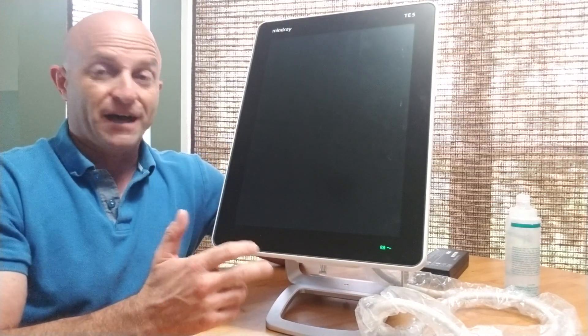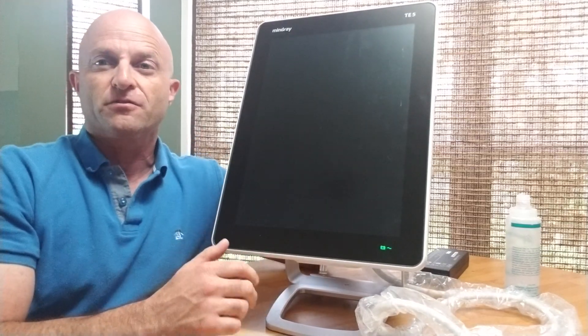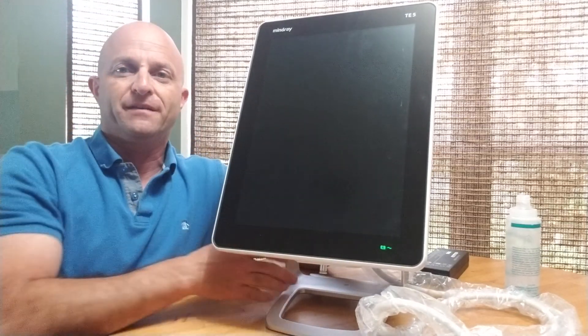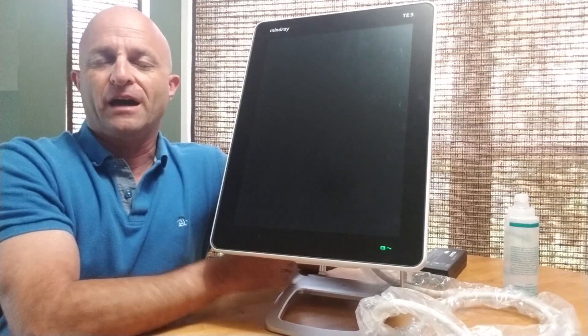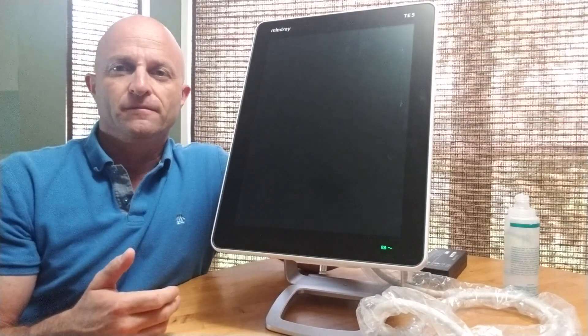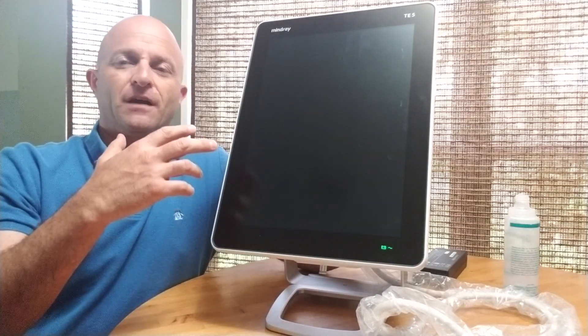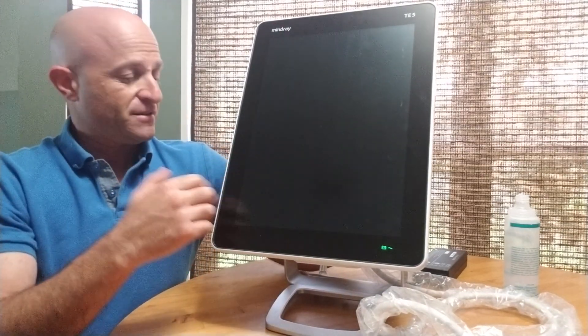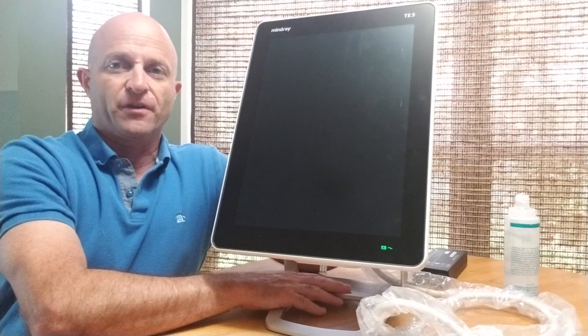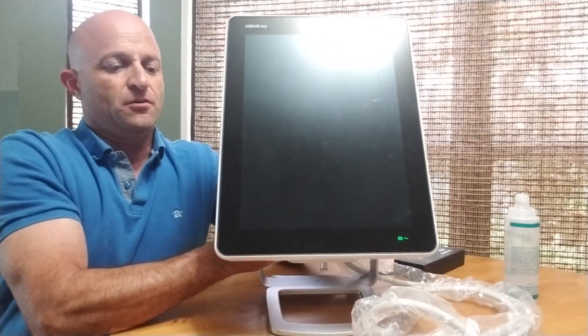It's got a lot of great features, one being the table stand. It has options for a cart, wall mount, or this great table stand.